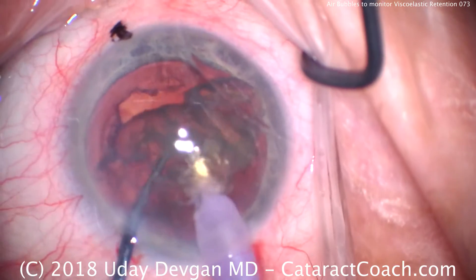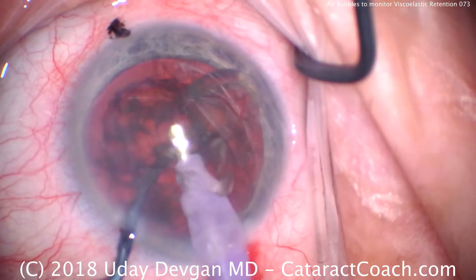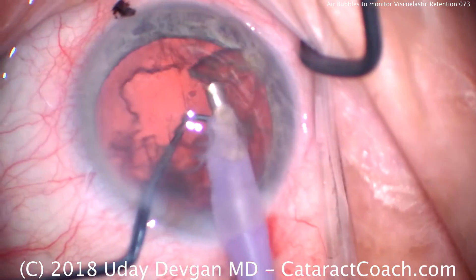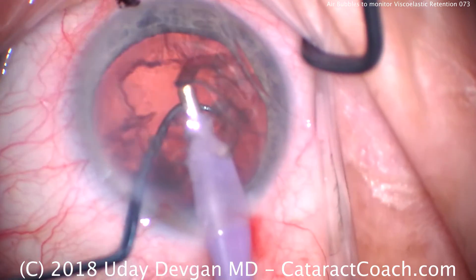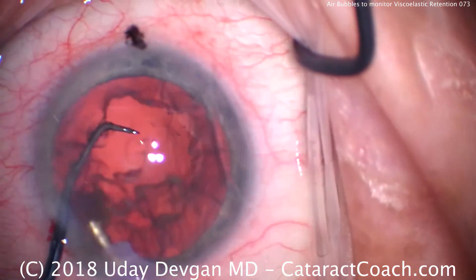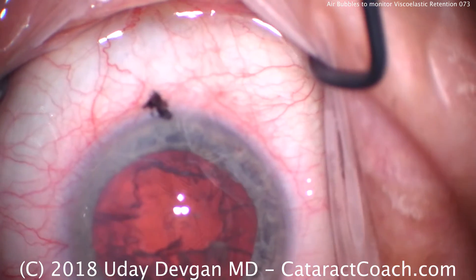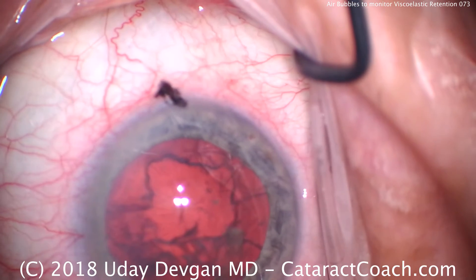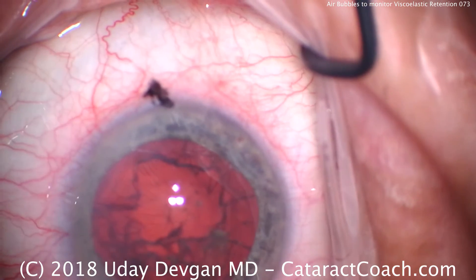Chopper is just feeding the piece towards the probe. We're going to examine again — we'll see centrally the amount of bubbles that are remaining. Last bit of nuclear pieces coming out; note that the chopper is in that safe position to protect the posterior capsule. Switching to the I/A probe — depending on the light angle, you should be able to see there's still a good number of bubbles along the corneal endothelial surface.